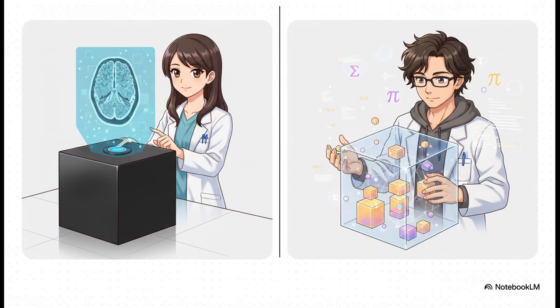First, you've got the commercial vendors, what we call the black box. This is a perfect, validated, turnkey solution. You're not supposed to mess with the insides. You just pick a setting, like reduce metal artifacts, you push the button, and you get a beautiful, reliable result every single time. Then, you've got the complete opposite, the open source glass box. This is a playground for scientists. It gives them all the building blocks, all the individual pieces, so they can tinker, experiment, and build totally new algorithms from the ground up.